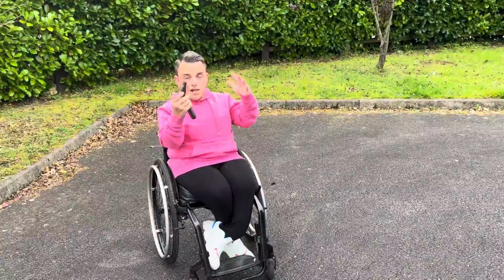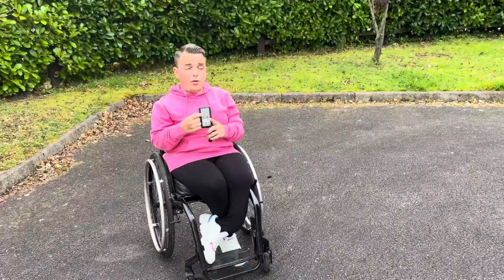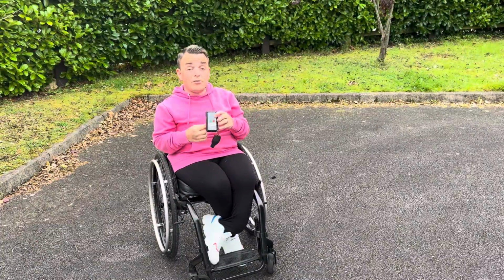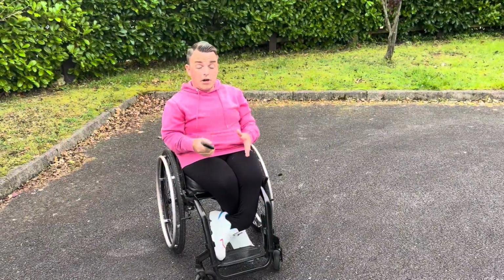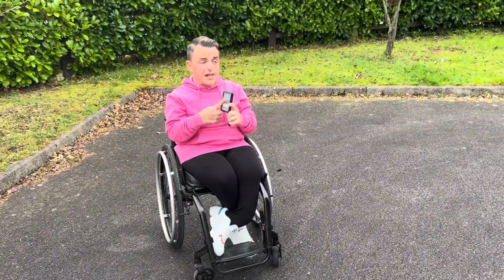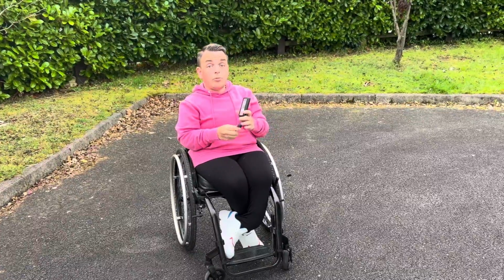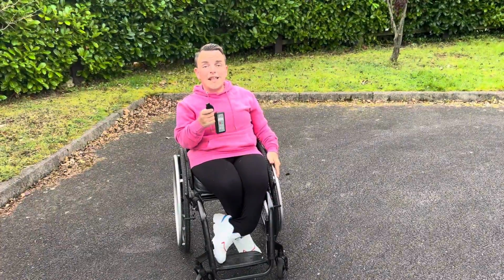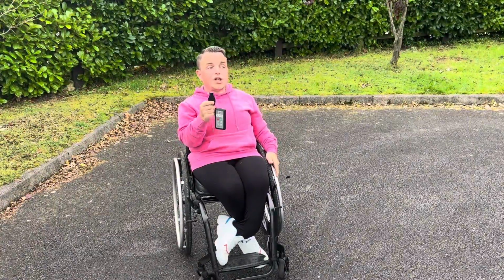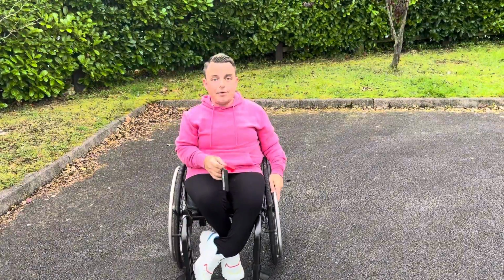So once the tailgate's open, you would then switch to this remote, and with this one you would unfold the lift, then press down, which would bring the lift down. You get on the lift, and then once you're on, you go up. Again, all controlled by this. Once you're in the van, you click fold, which folds the lift, and then you go back to the van key and click the tailgate button, which would then close the tailgate once you're in the van. So you literally would not need any assistance from anyone at all.